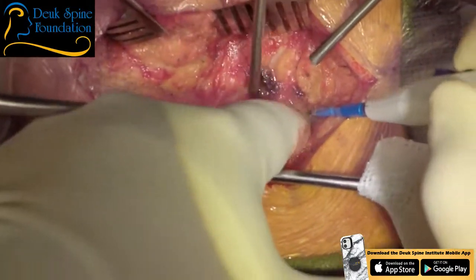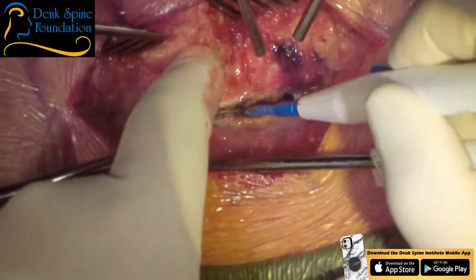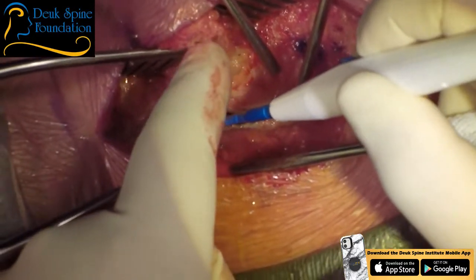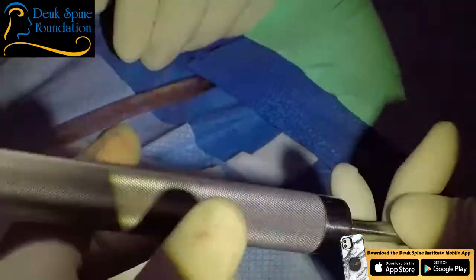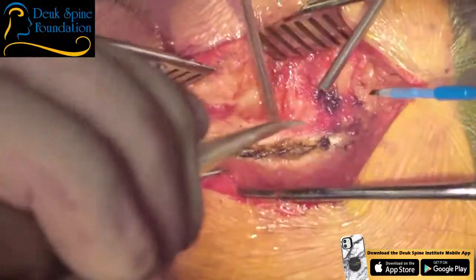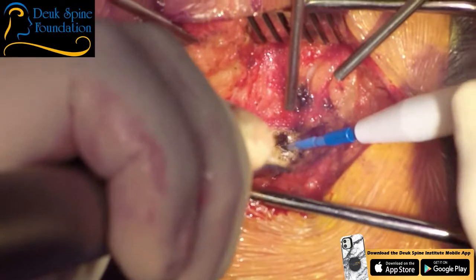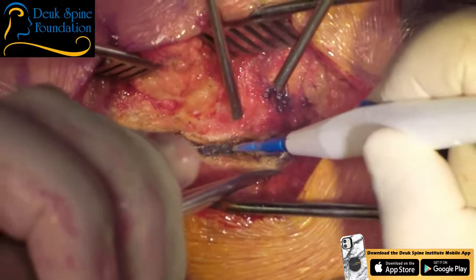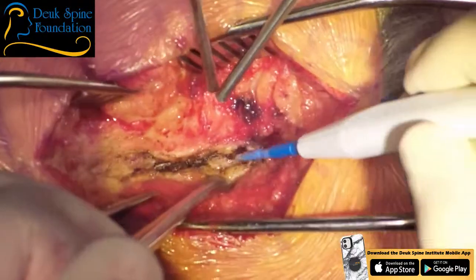And the decision about what surgery to do is always made before we get to the operating room. So I've honestly probably once in my entire career ever had to tell a patient, oh yeah, I got in there and I found this and that and I had to do something different. I mean, if you plan the surgery out properly ahead of time, you know exactly what needs to be done. So I'm going through the dorsal fascia right now. And can we put you've got it up there? How's the view up there? All right, good.